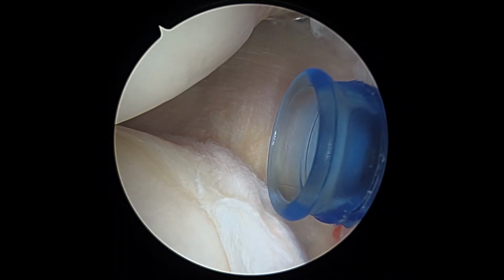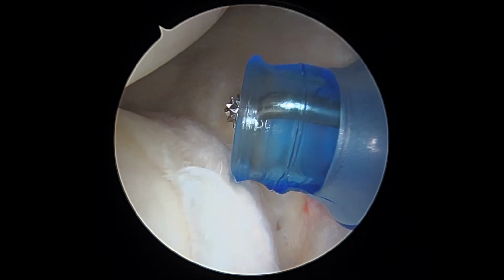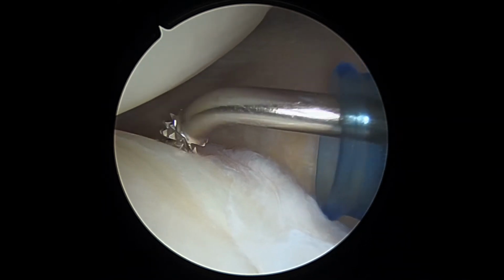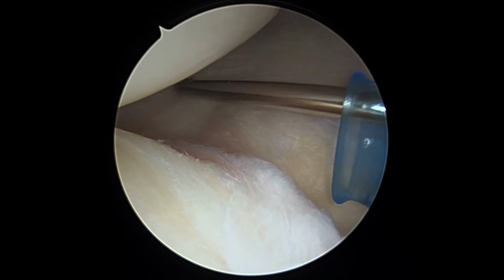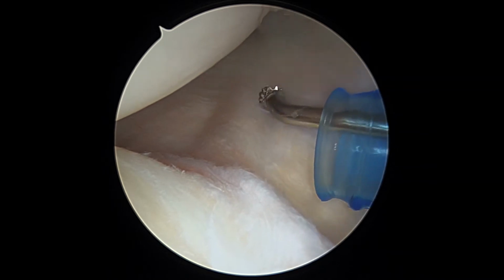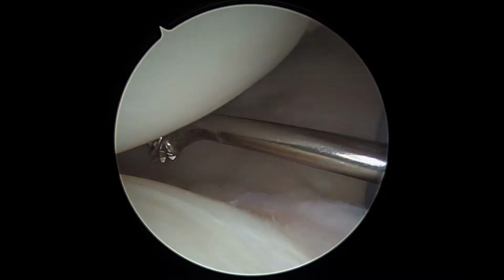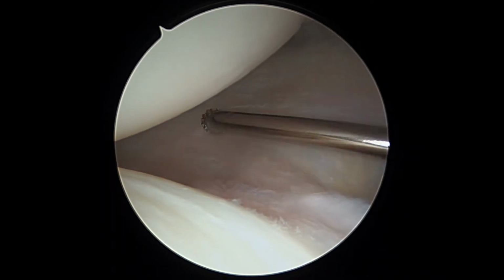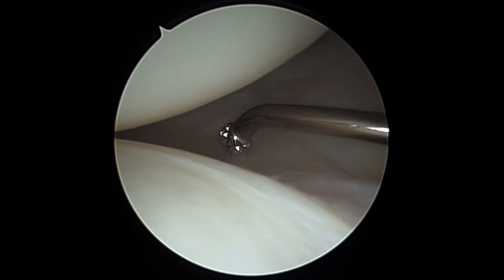I'm going to take a little instrument called a rasp, and we're going to gently roughen up the capsule here. This looks like one of those medieval torture devices, but it just really gently roughens up the capsule here to create a healing response. This posterior capsule is very thin. We don't want to penetrate it, so we're not trying to remove anything. We're just trying to make it more like a piece of Velcro. And as we do this, you can see how that looks. You just gently scuff it up, basically.